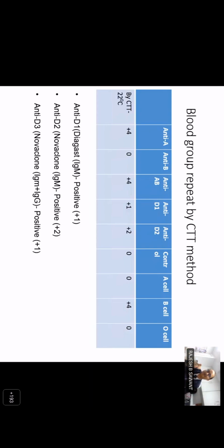Then, if you are sure that this is weak D, that individual can get an RH positive transfusion. Moreover, if it's a male patient, decision making becomes simpler. But if it's a female who is going to go ahead with pregnancy, etc., then you have to confirm again. So for any kind of RH variant, it is always recommended to do genotyping.